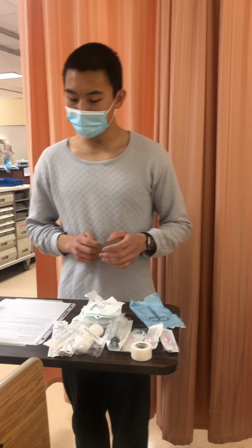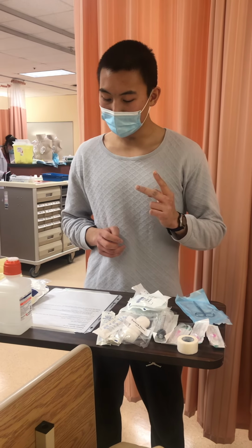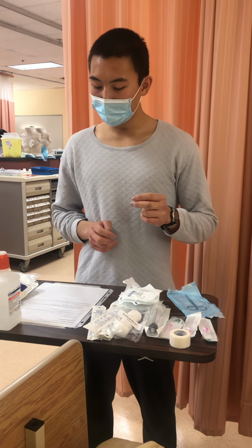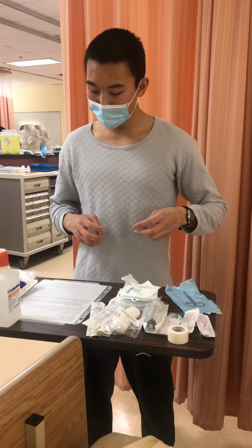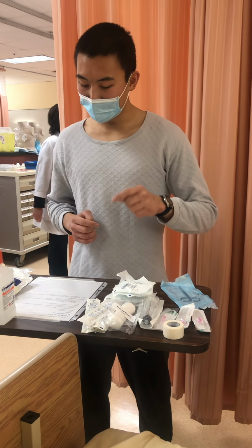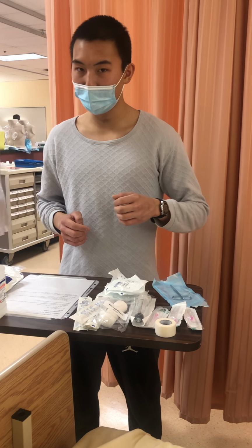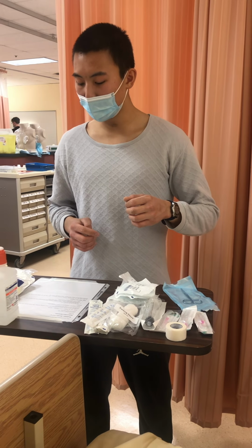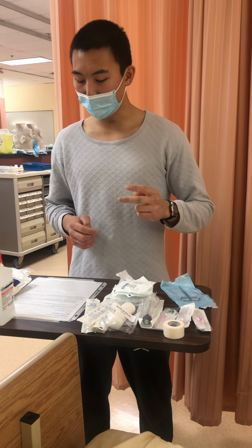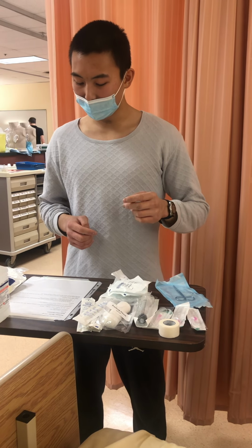Okay, so I have my physician's order for my patient Drake Gray, and he was admitted 2 days ago with burn injuries. He was admitted for burns on his abdominal area, and my orders for him are to change the dressing once a day on the ABD pad, irrigate with normal saline, pack with normal saline soaked 3-inch Kerlix, 2 4x4s, cover with ABD pad, and secure with paper tape.